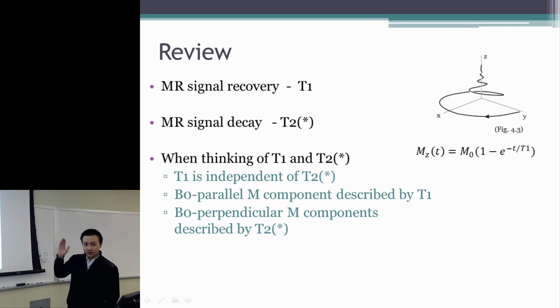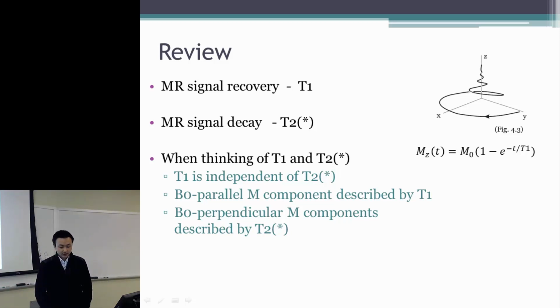If you just tip the equilibrium magnetization to the transverse plane and let it freely decay and recover, this is true. But if you apply multiple RF pulses, this is a little bit misleading. So we need to understand that.